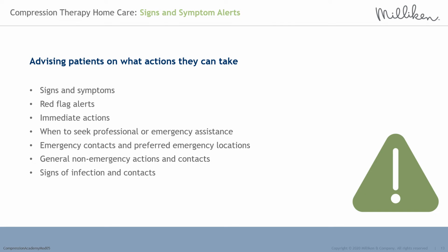The importance of and when to seek professional or emergency assistance needs to be explicitly advised. Ensure all emergency contacts and preferred emergency locations to attend are detailed in the patient information leaflet or document issued to the patient when compression therapy is initiated.